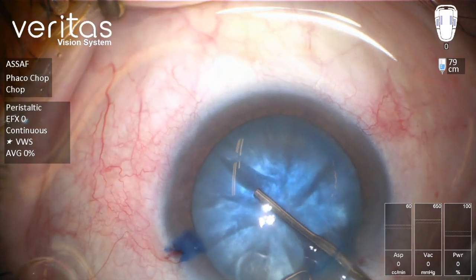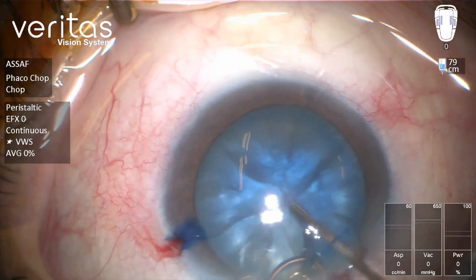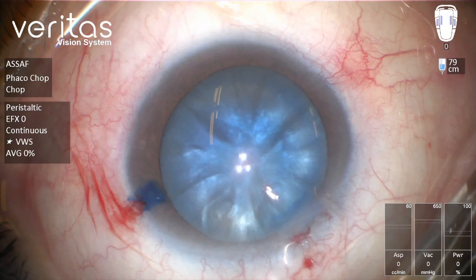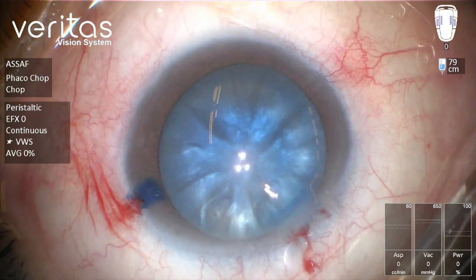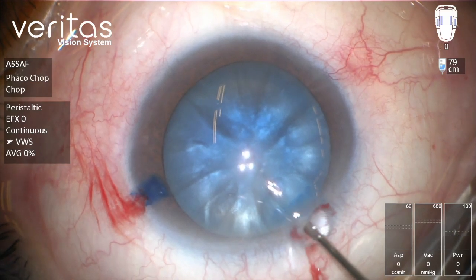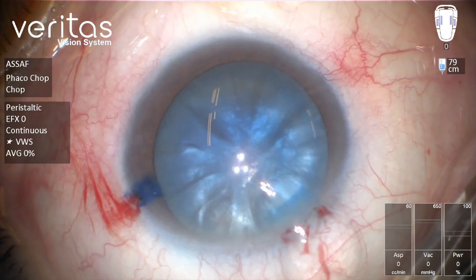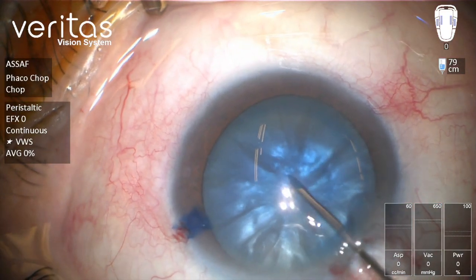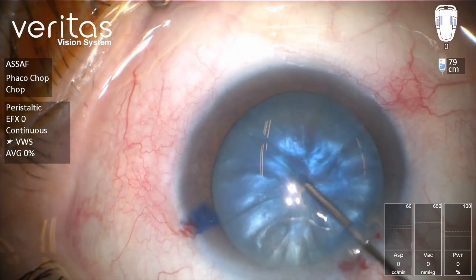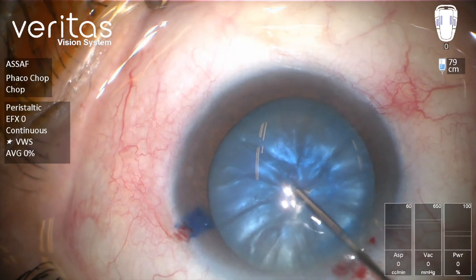You can see those particles are moving, and this denotes that the lens capsule is overstretched by the liquefied cortex. We'll inject more OVD.